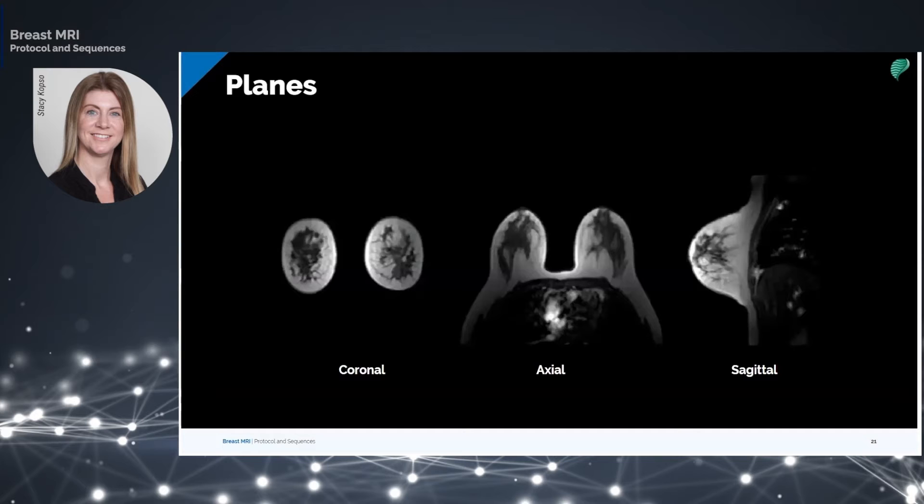Breast MRI consists of different sequences on three planes: sagittal, coronal, and axial.